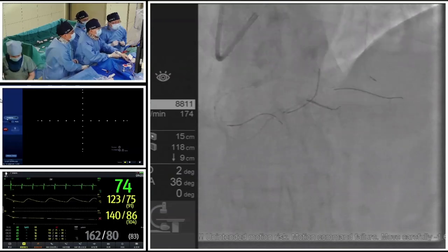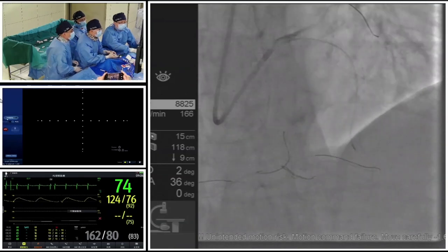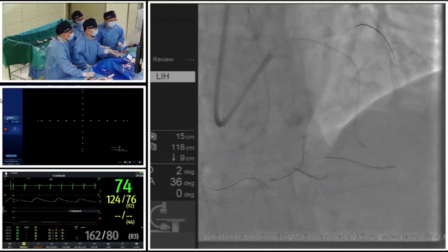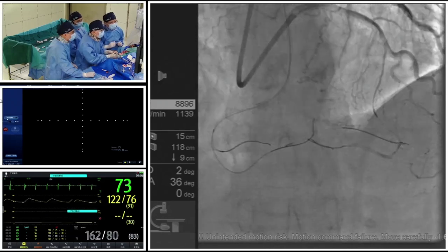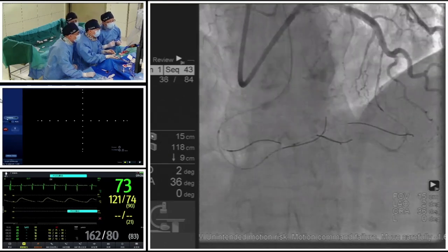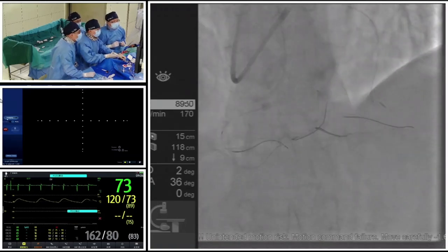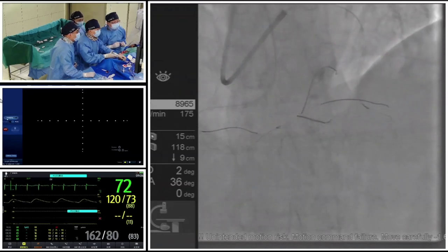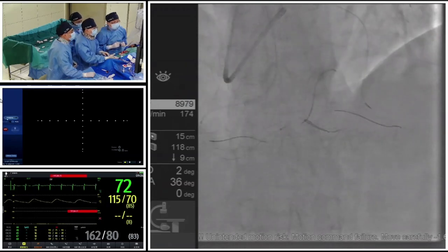One thing is that it's relatively easy to perform. We push the microcatheter just proximal to the perforation and use the microcatheter to deliver the absorbable sutures. We cut them into small pieces, something like 0.5 centimeter or 1 centimeter, and use the microcatheter to push the absorbable sutures to the perforation site. We can select how many segments of absorbable sutures to place into the occluded segment.